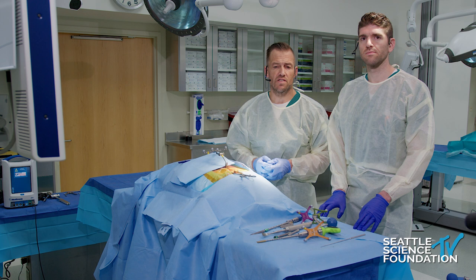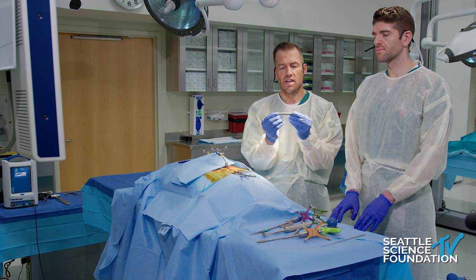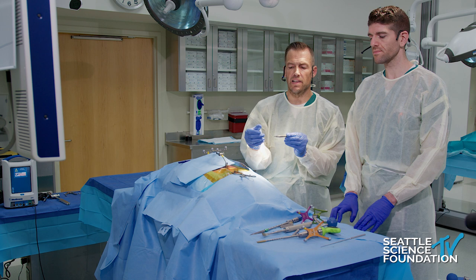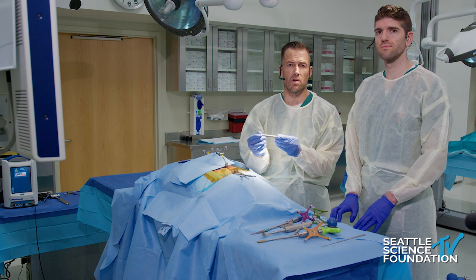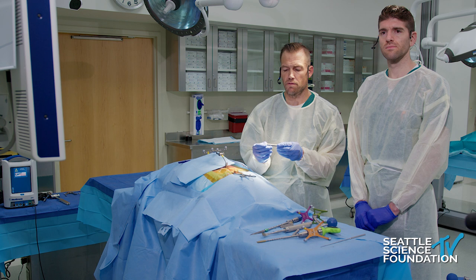Today we're going to demonstrate a stacked granite — meaning two screws that have a tulip head. It's a 3D printed titanium screw that facilitates both bony on-growth and bony in-growth. It has harvesting ports at the leading edge of the screw, so as we advance it across the sacrum into the ilium, it harvests bone that fills the screw and supplies bony through-growth, affecting sacroiliac joint fusion and increasing the rigidity of the distal end of our construct, hopefully preventing construct failure.